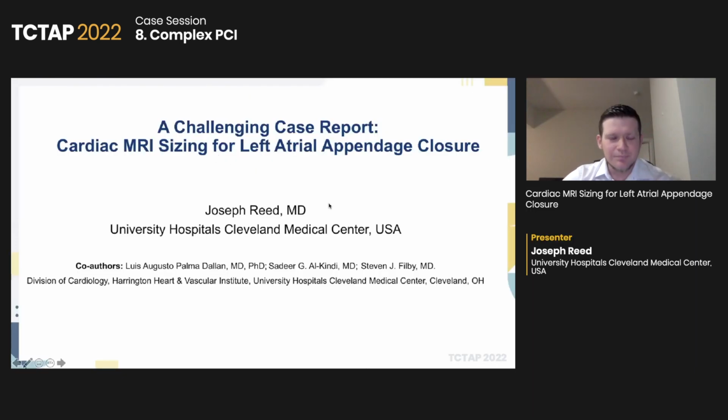Hello, everyone. My name is Joseph Reed. I'm a PGY1 in internal medicine at University Hospitals in Cleveland. Today, I'll be talking about left atrial appendage closure using cardiac MRI for device sizing and pre-planning.